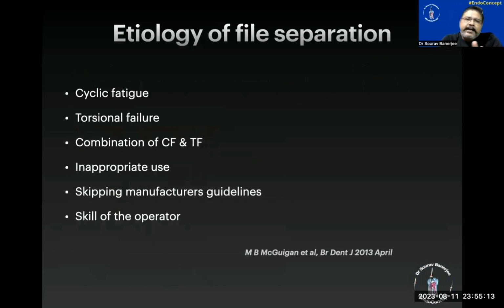So let us see the etiology of file separation, like why files separate in an endodontic canal.